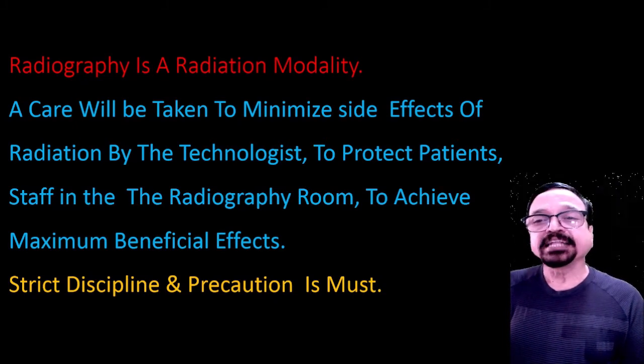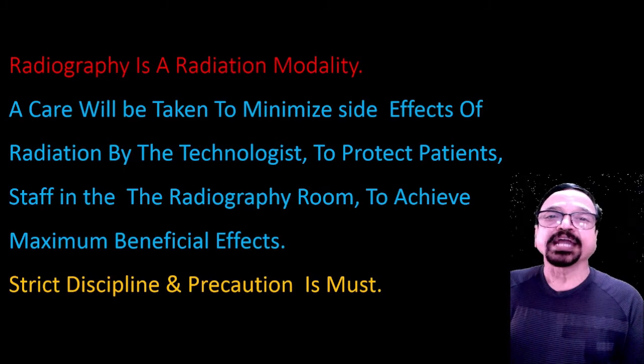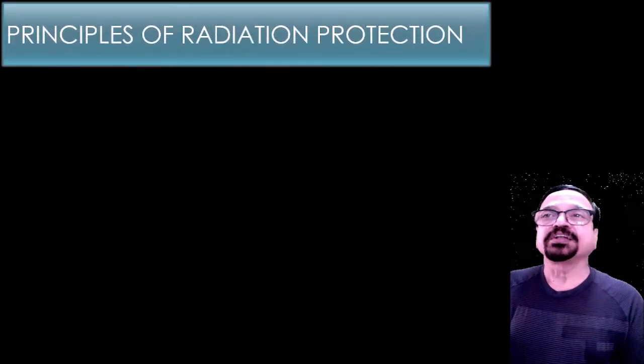Strict discipline and precaution are a must, since it is a radiation field. Who should enter, who should not enter, and what the indications and contraindications are, are all covered in different lectures. The designing of the radiography department and how patients are protected outside and inside is also extensively covered in different lectures. In this lecture we are concentrating only on radiography.